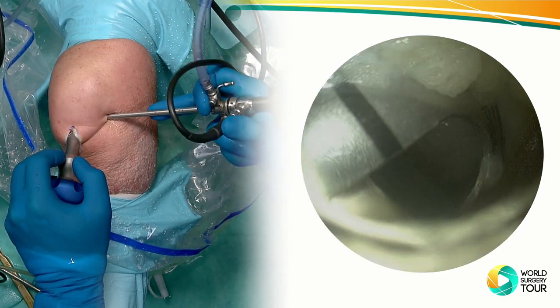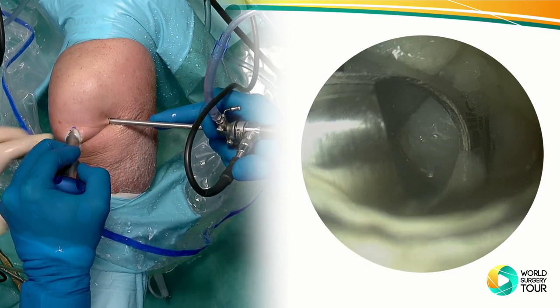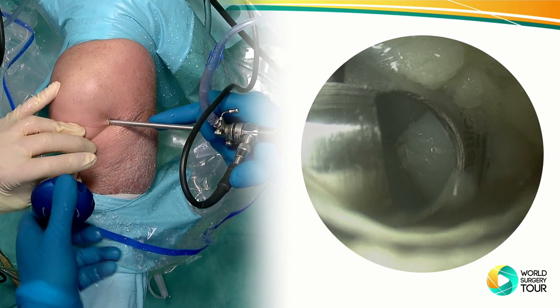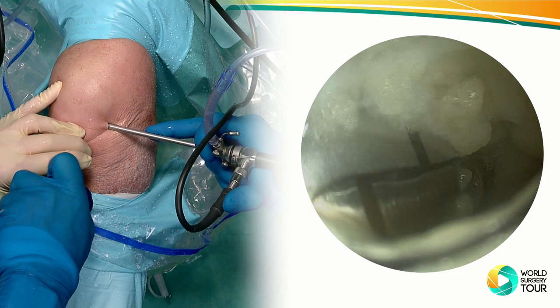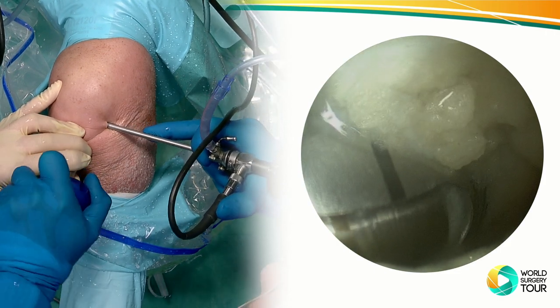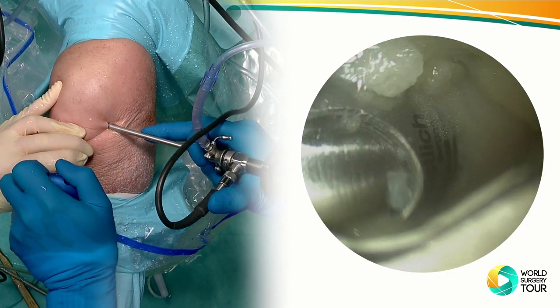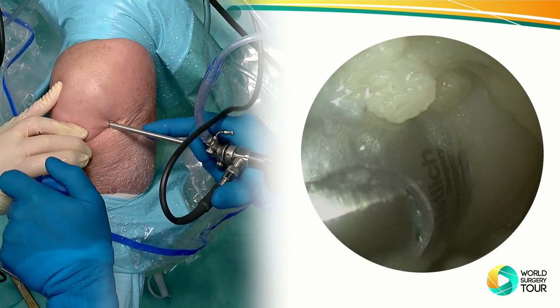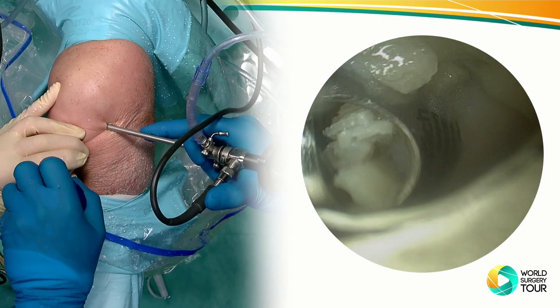Actually, it's a drill who can harvest. So again, you can control. You have to apply a certain firm pressure, and then clockwise. You're just gonna harvest now and remove the cartilage from the lesion side. Okay, center. Careful, we need to see that it has to be.